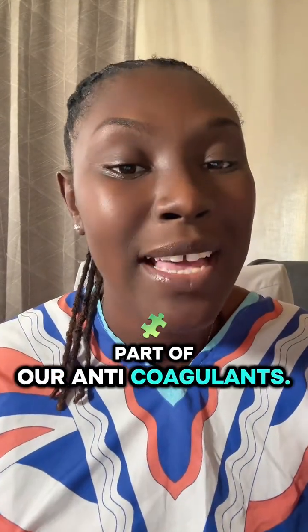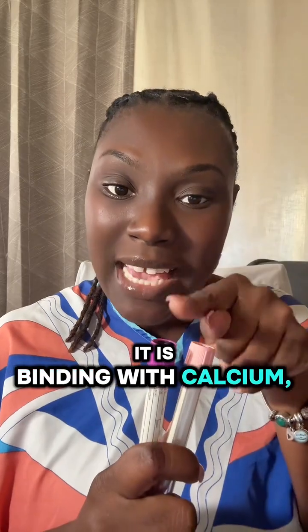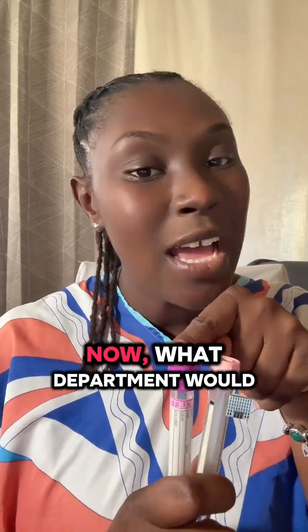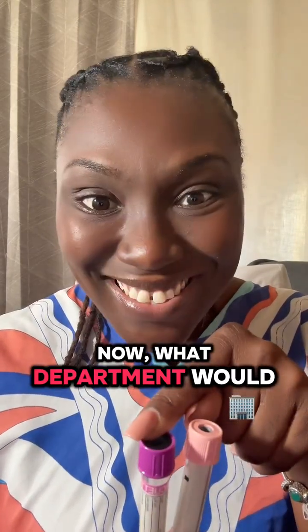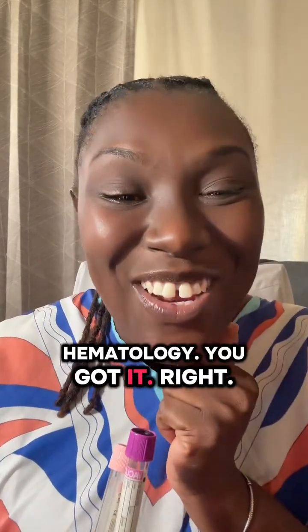Next, we have our EDTAs, okay? This is still part of our anticoagulants. Now, we have our lavender and our pink. We also have the royal blue with the lavender strip on the side. EDTA, it is binding with calcium, which makes it an anticoagulant tube. Now, what department would you send this beautiful tube to? Hematology, you got it right.